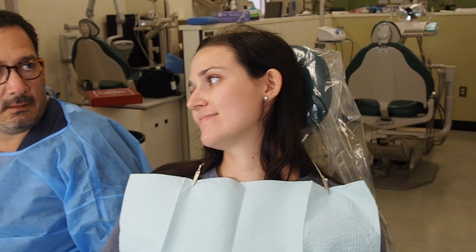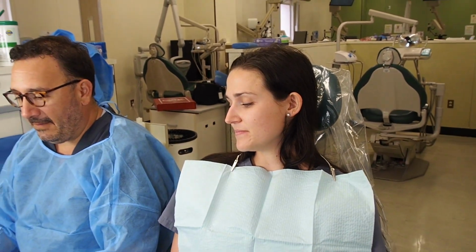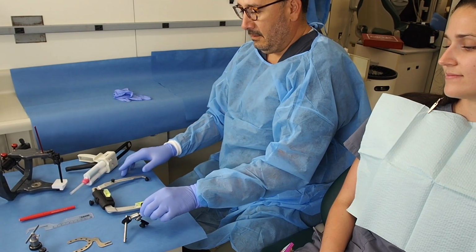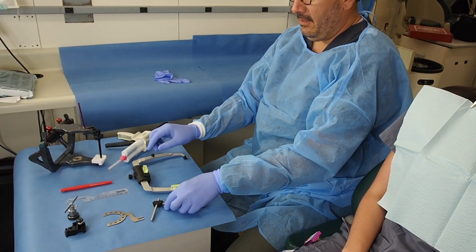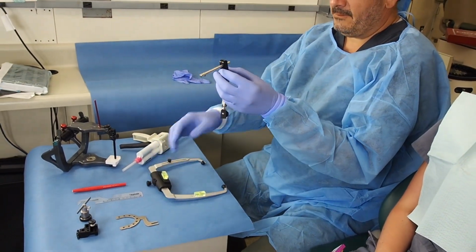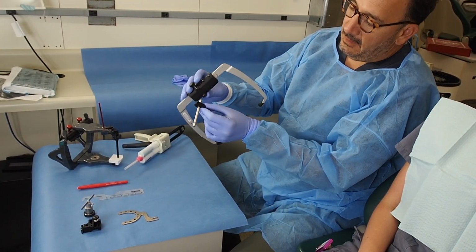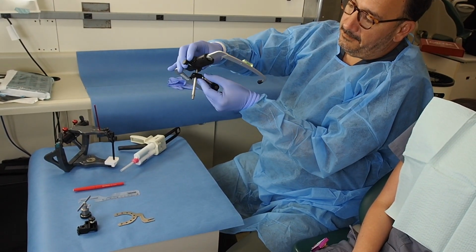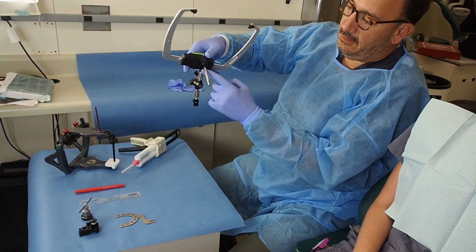Facebow taking 101. In order for us to take or make a Facebow record, we will need the following. Facebow, then the Facebow will connect to the bite handle or the manual part. The shorter portion goes to the top. Always. There's only one way that goes in. You see that, guys?